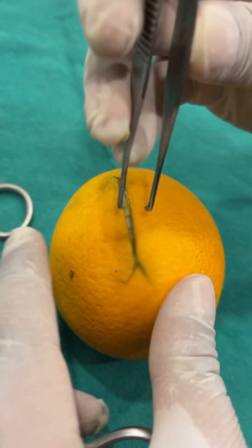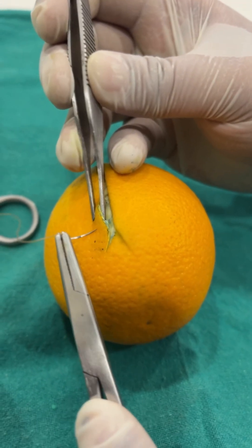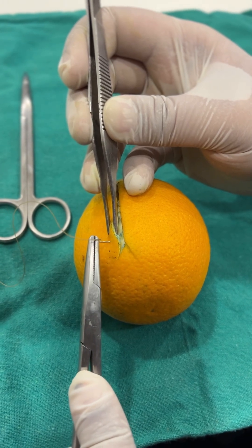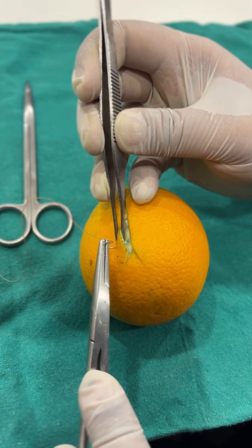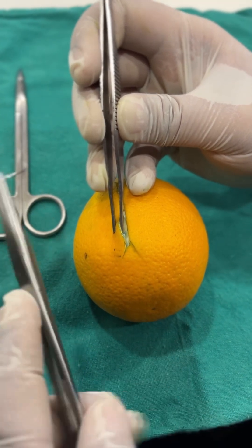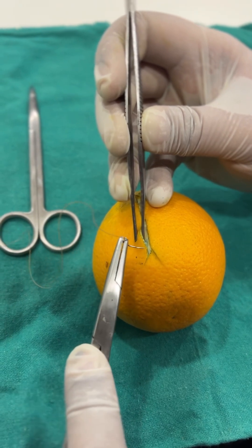To start suturing, hold the flap with your Adson forcep and take a bite. The bite should be perpendicular — not slant or oblique — it should be perpendicular to the tissue surface. When you take the bite you don't have to push it; move along with the curvature of the needle. Regarding depth, in general it is twice the depth of the wound — so if the wound is one millimeter deep, you take the bite at two millimeter distance from the incision line.